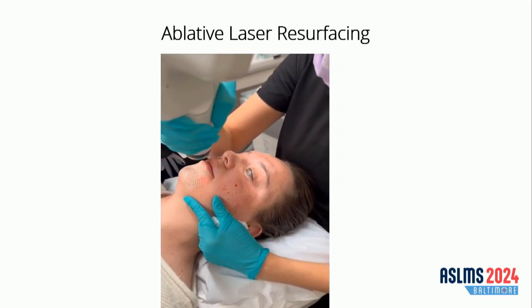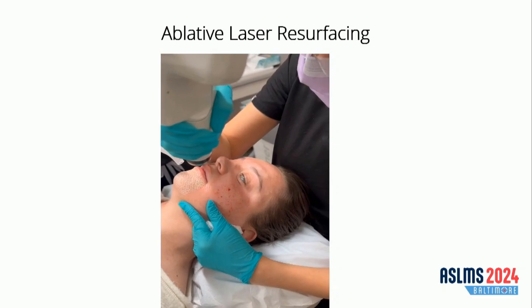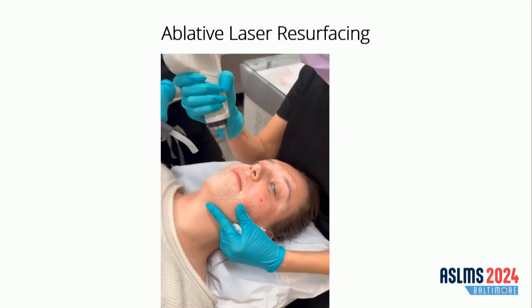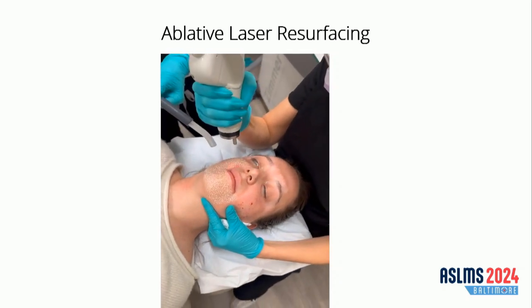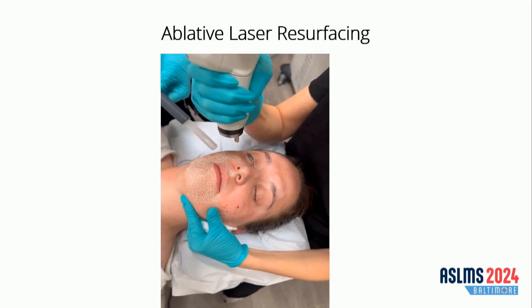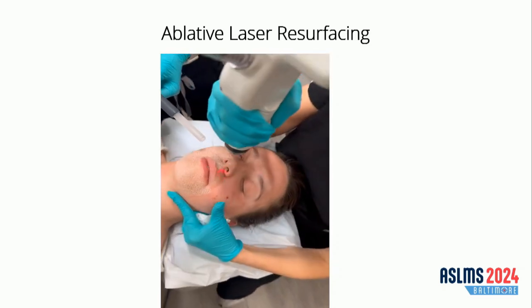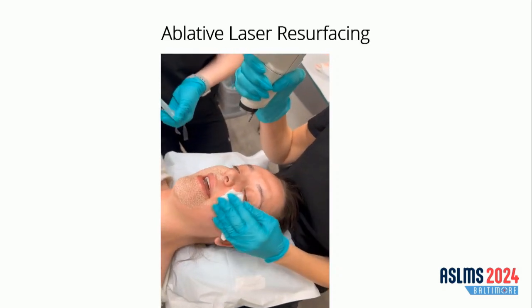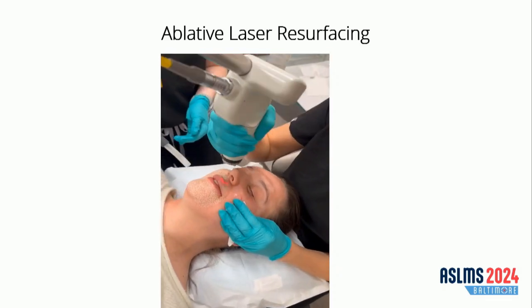You can, of course, do fractionated CO2, so that's what I'm demonstrating in this video. I have more recently gravitated toward performing fully ablative erbium in a lot of my patients, especially patients who have just advanced lip lines. You really can't substitute the results that you're able to get from those fully ablative procedures. And I'll often even do that and then fractional CO2 the rest of the face.